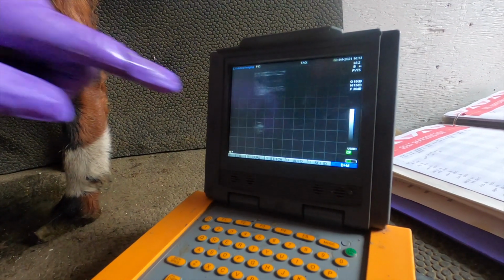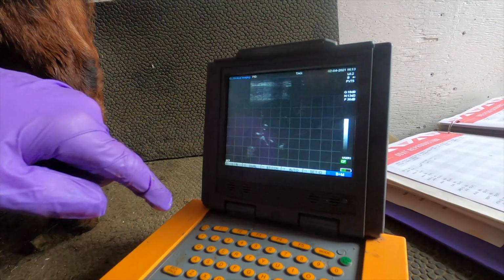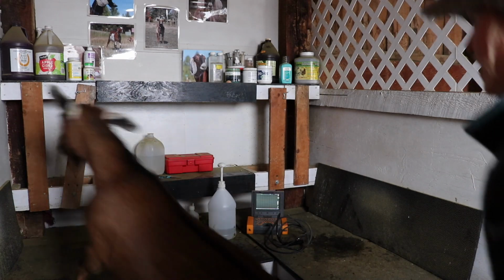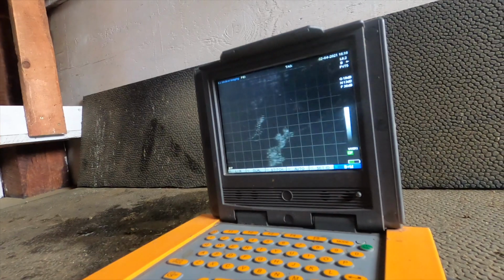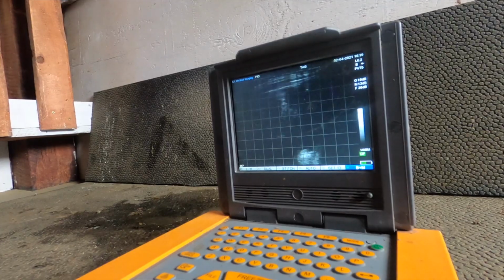That's a leg you're seeing right here, this white thing. This is the umbilical cord coming down. Ribs. Back to ribs, yep. There. Goat number 2 is pregnant. Cool. Very good. Good job. You can do this. That looks like a spine. Little bugger just moved. It's shy. Probably knows it's being watched.